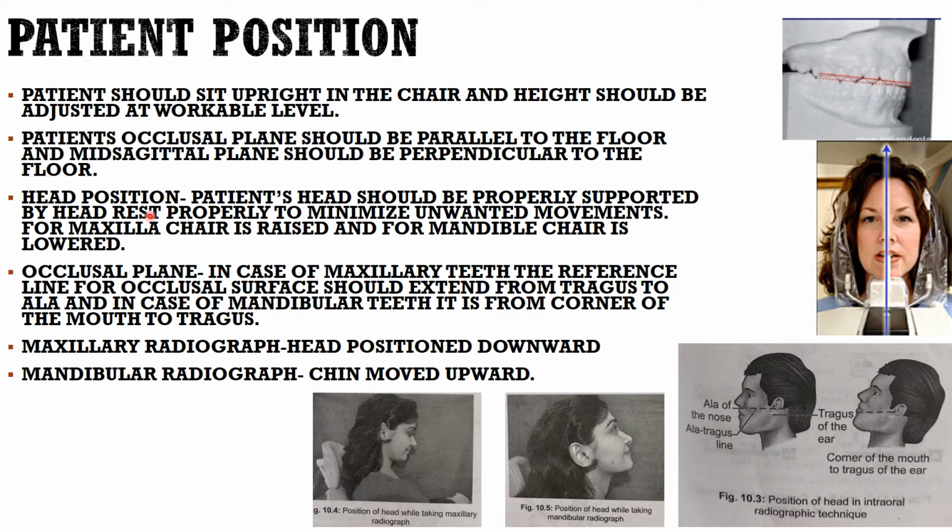What is the head position of the patient? The patient's head should be properly supported by the headrest to minimize unwanted movements. Now for the maxilla, the chair is usually raised, and for the mandible, the chair is lowered.